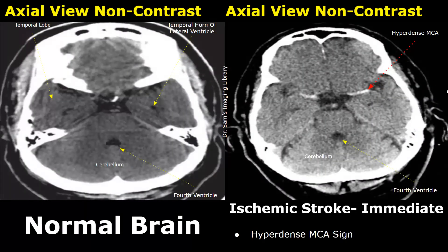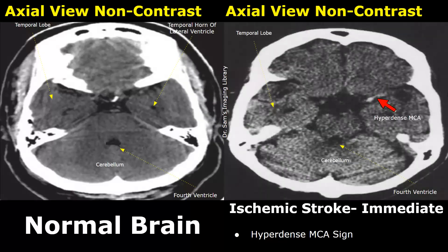these are images of the brain at the level of the cerebellum. This is the cerebellum; this is the fourth ventricle. These two lobes are the temporal lobes. The location of the middle cerebral artery is at this point. In this image of ischemic stroke, we can see a hyperdense MCA. The middle cerebral artery is the most common artery involved in stroke.